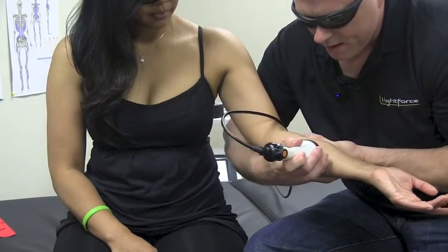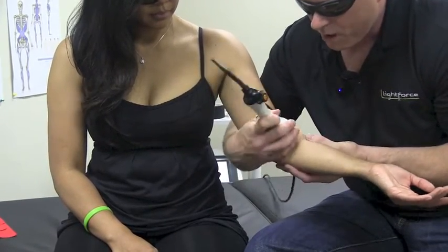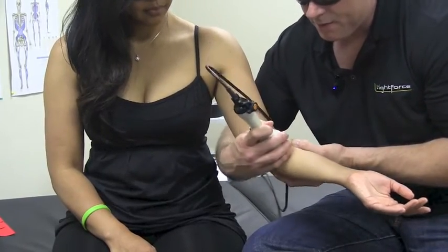I'm going to come in from here and go up inside the arm and work more of the flexor tendons of the forearm.